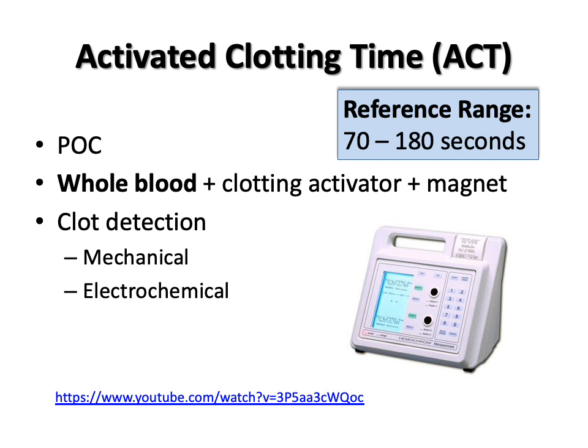The activated clotting time, or ACT, is a point-of-care test that is usually performed on patients that are in the ICU or CCU following cardiovascular or vascular surgery, and patients undergoing extracorporeal membrane oxygenation or ECMO, cardiac catheterization, and hemodialysis.